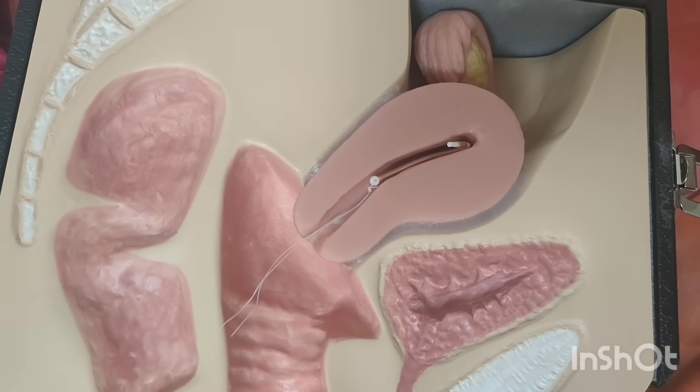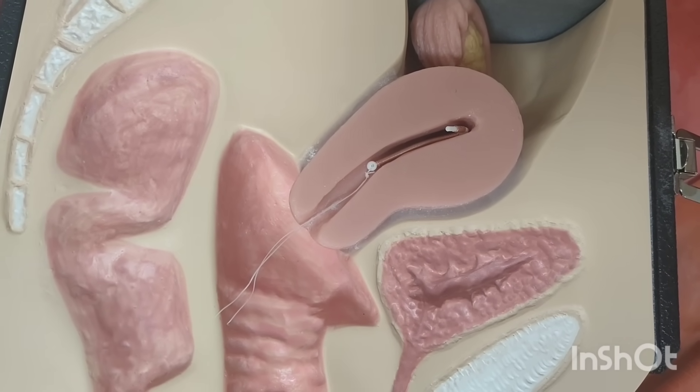Your copper T is placed, and the technique is: push, pull, push.